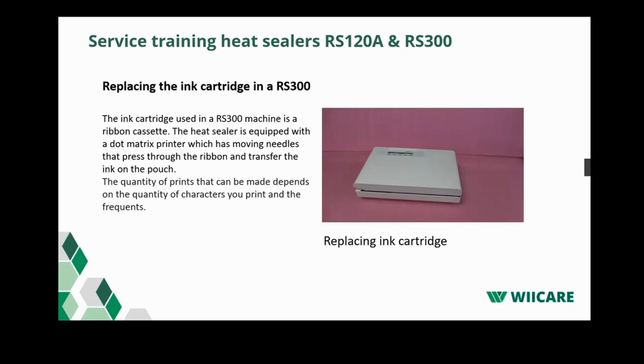Now we made one extra section on replacing the ink cartridge for the RS300. The ink cartridge used in the RS300 machine is a ribbon cassette. Within the heat sealer, there's a dot matrix printer with 9 needles, which print through the ribbon. Of course, it's important that when you reinstall the ribbon it is done correctly. So this video shows how to do it.